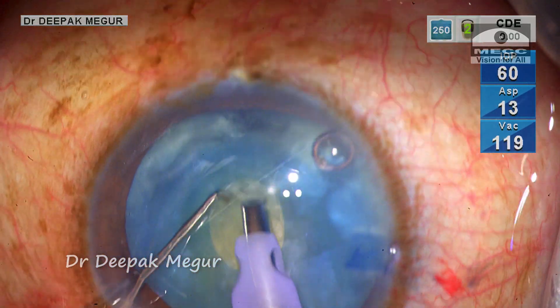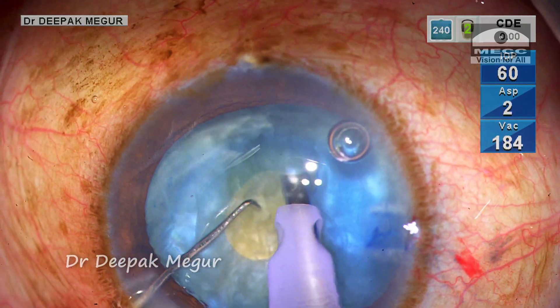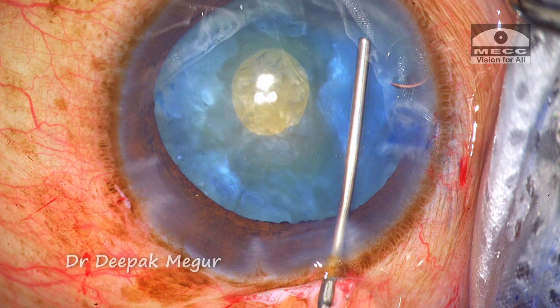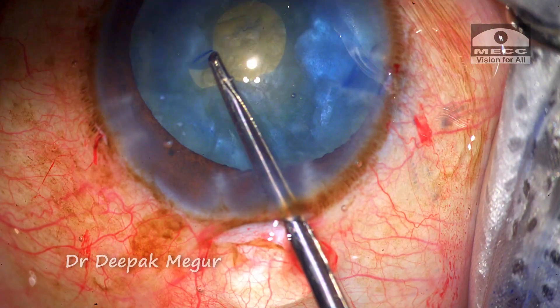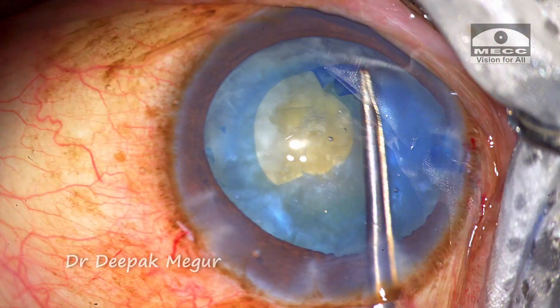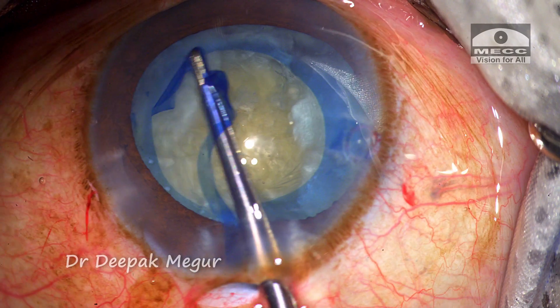The decompression is continued until I feel it is safe enough to proceed to the secondary rhexis. OVD is injected and then using micro scissors a small tangential cut is given. The forceps is then used to complete the larger secondary rhexis in a very controlled manner.